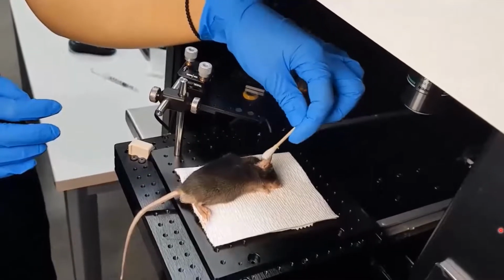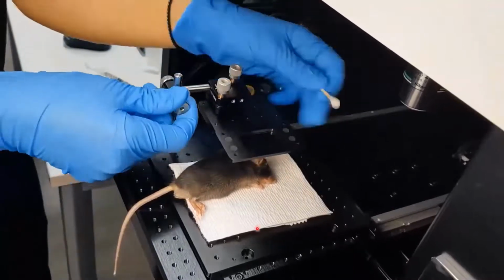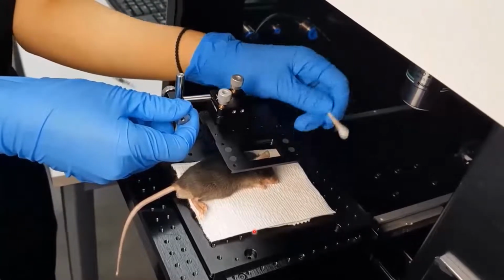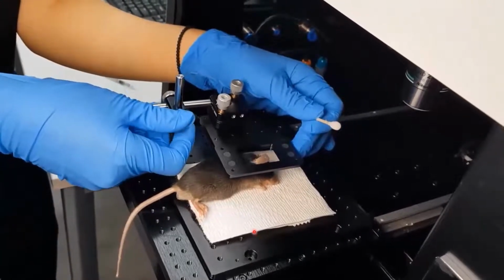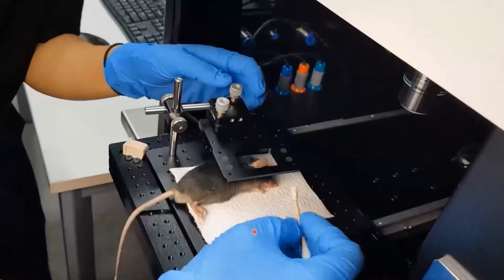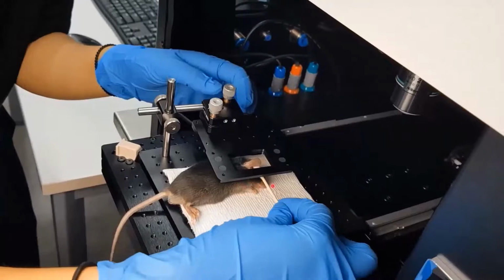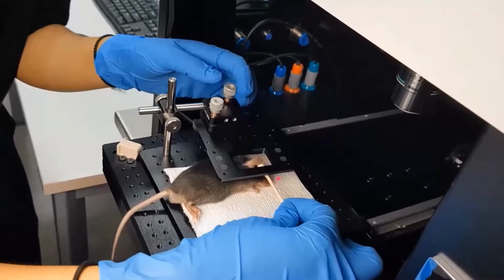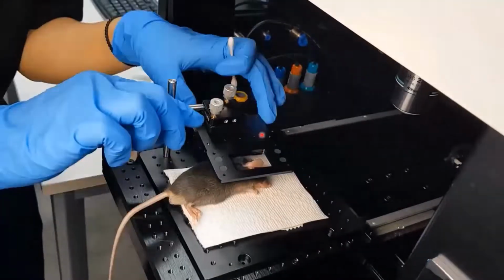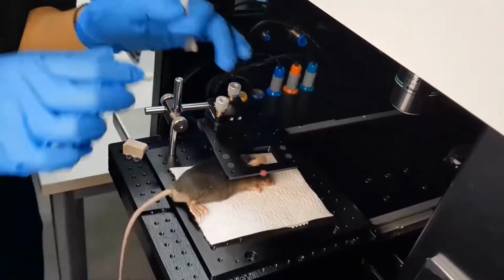Then the mouse model is mounted on the IVIM stage with the heating plate, and apply saline on the surface of the ear skin imaging area. Then cover with the cover slip. We place the ear skin in the middle of the cover glass, preventing air bubbles from being captured in the imaging field. So we make the imaging tissue fully attached to the cover slip, and mount the imaging organ like this.